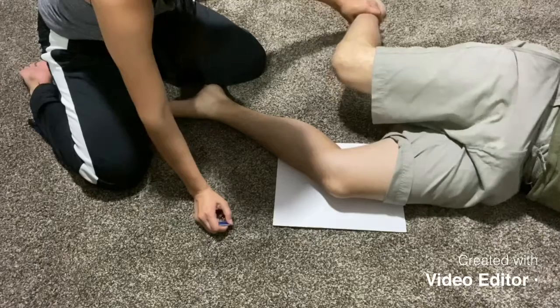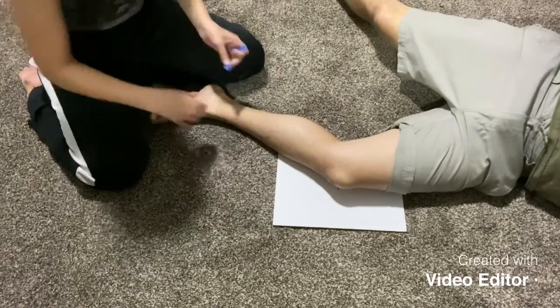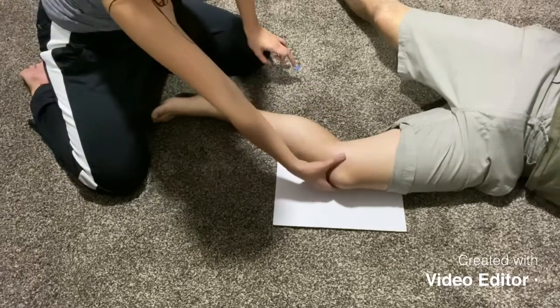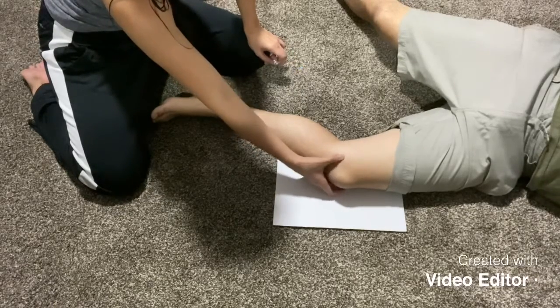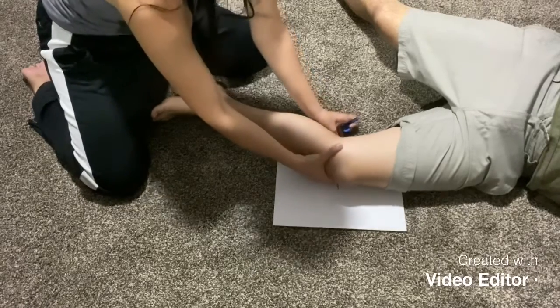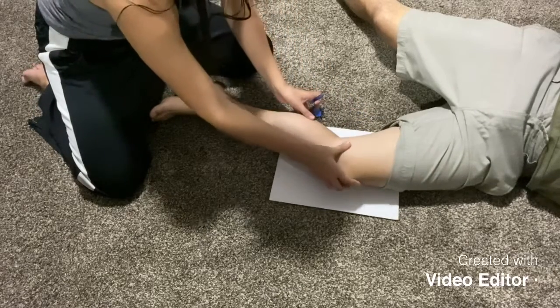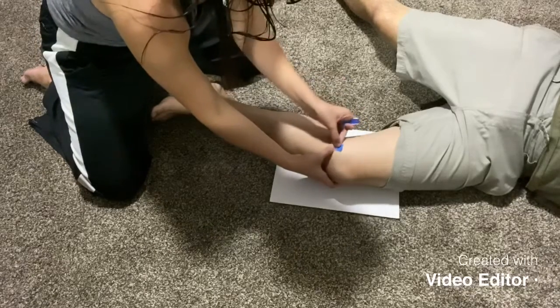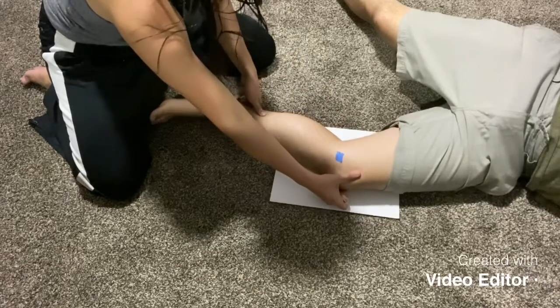Is that okay if we get that out of the way? Sorry. Okay, so the knee should be flexed 20 to 30 degrees. The patella and the epicondyles here should be perpendicular to the IR. And here we're centering to the knee joint and at 1 inch below the medial epicondyle. So I'm going to bring this in just a smidge, about right here. Making sure we're at the true lateral here.